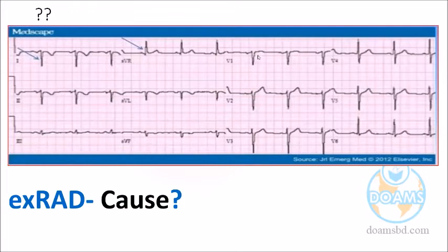Normally, we can say simply, usually there is a progression of the R wave from V1. Progression of the R wave means the height of the R wave progressively becomes taller. So this is V1, this is V2, this is V3, here is V4. So it is following this, progressing. V4 or V5 will be the tallest, right? Maybe somewhere in V5. It depends upon slight positioning of the leads. So it is normally following.